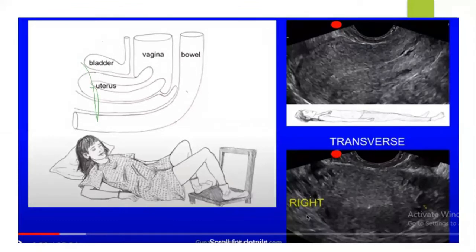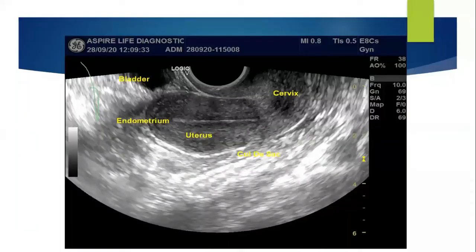Hope this part is clear, because if you haven't understood how to insert the probe and how to orient the image in transvaginal scan, then the further learning is going to be difficult. So today, once this class is over and you go back home, please do look into this picture and familiarize yourself with how to insert the transvaginal probe.